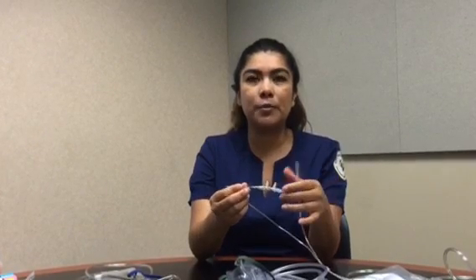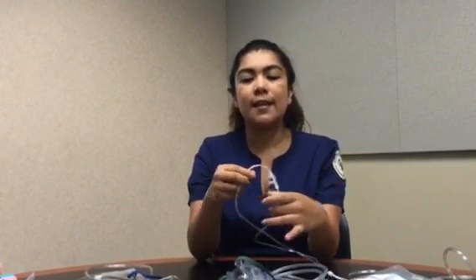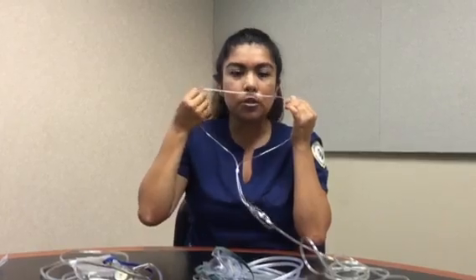And the way that we're going to be placing the nasal cannula on a patient is that there are some prongs right here attached, okay? And there's some prongs that come curved. If they're curved, you want to make sure that the curvature goes downward inside the patient's nose. You're going to go ahead and just put them inside the patient's nostrils, one for each nostril.